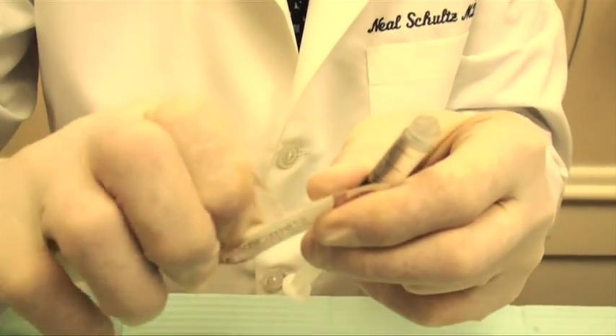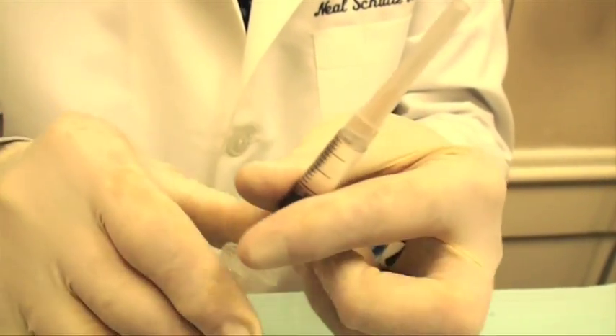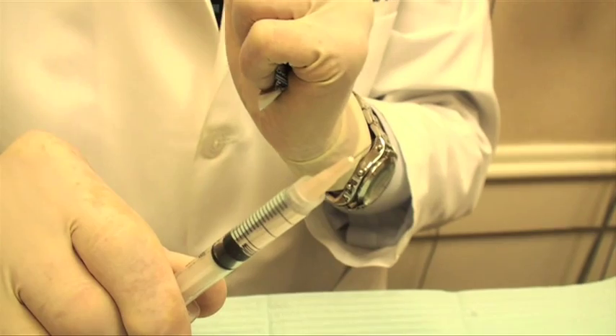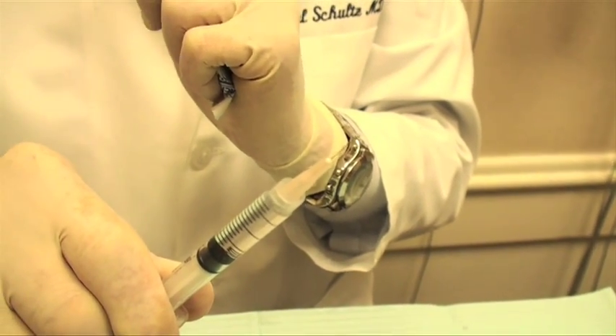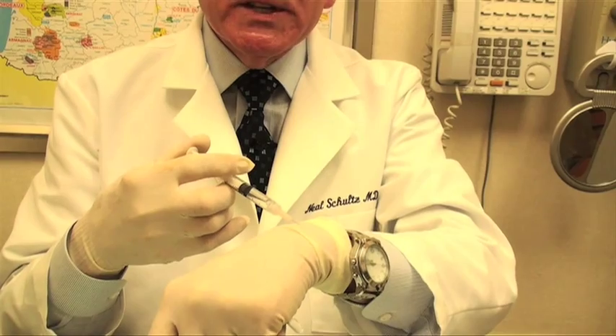This needle is probably one-fifth the diameter, and as you can see, this is a tiny, tiny needle with a very small tip. When I put this into your skin and put the anesthesia in, it's not very painful and you barely feel it at all. So at this point, we've actually put the anesthesia into the skin and we've made the skin numb.